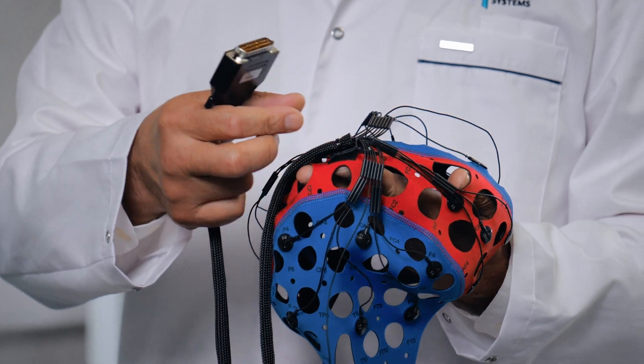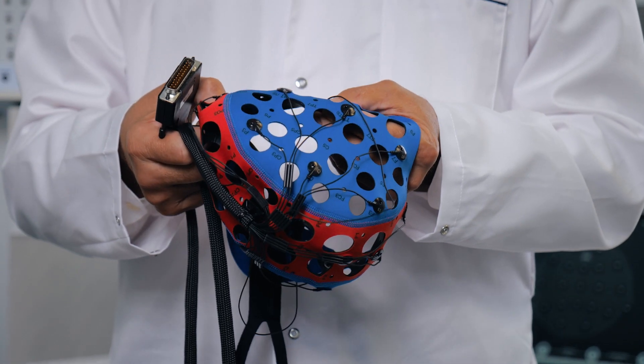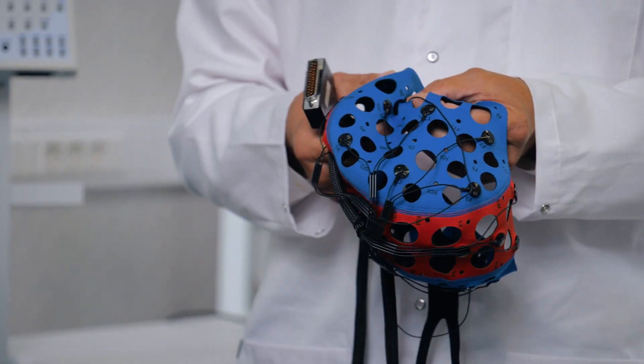The cable also exits from the top, allowing the patient to sleep comfortably. Flat electrodes are also used for the patient to feel comfortable and provide a good experience. Furthermore, these caps also make use of pre-installed electrodes for referencing in the mastoid projection, enhancing accuracy and reliability of measurements.